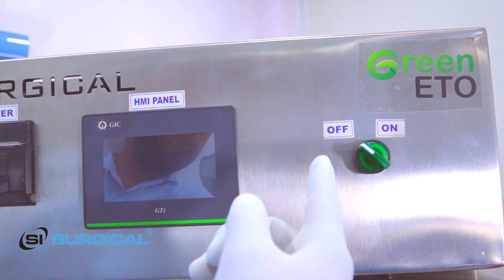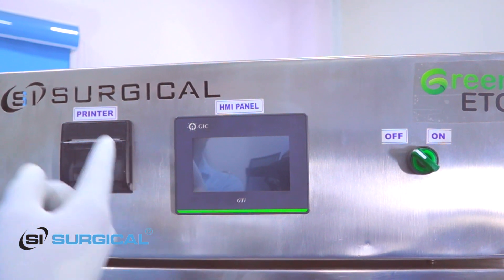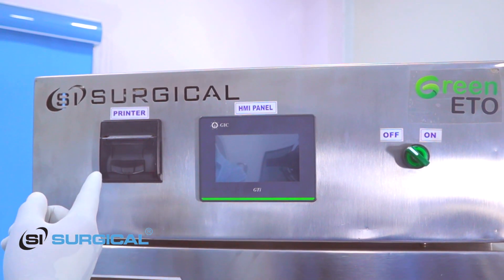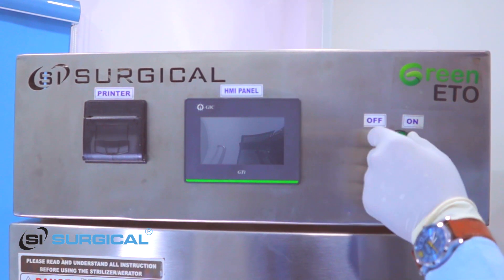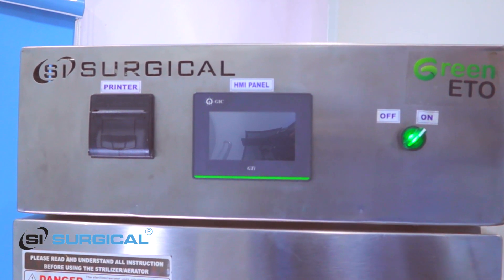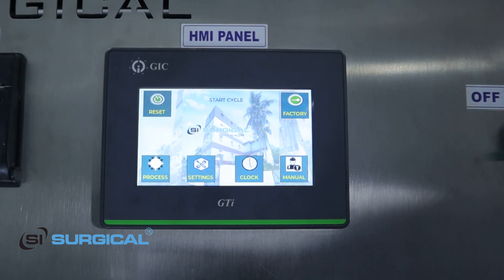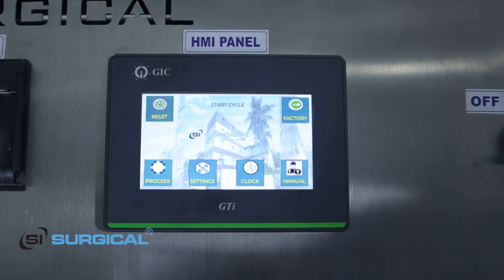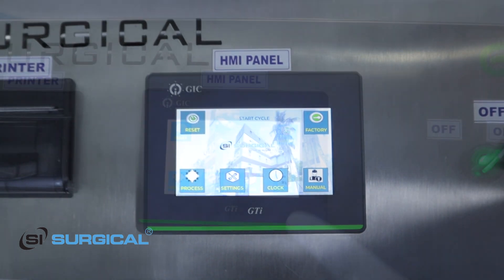This is our on/off button, this is our touch panel with display, and this is our printer for documenting the process. First I have to turn on this switch. You can see this is our touch panel display where we can operate, change, and manually operate the machine.